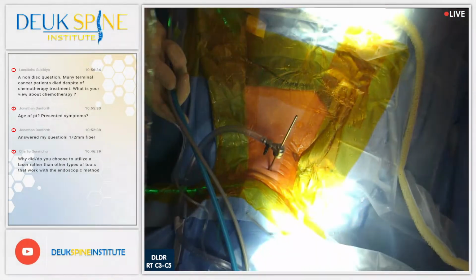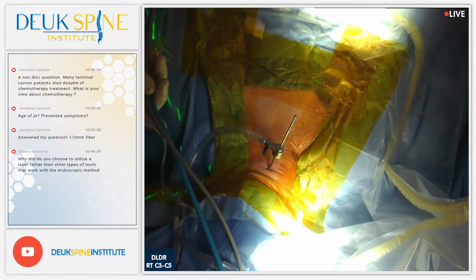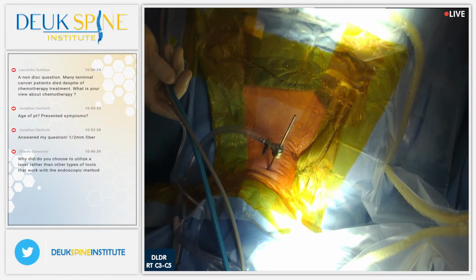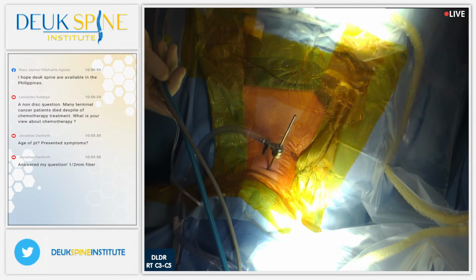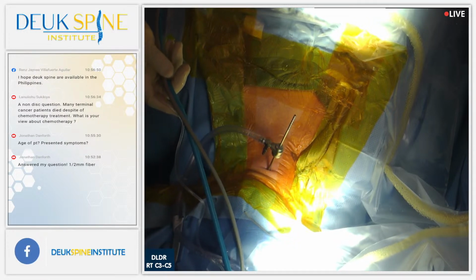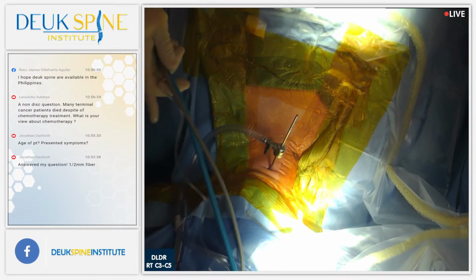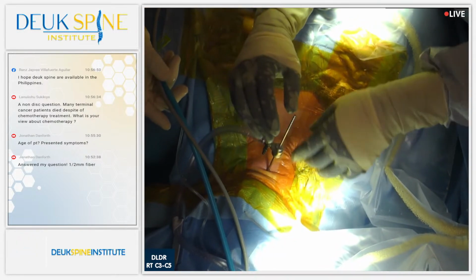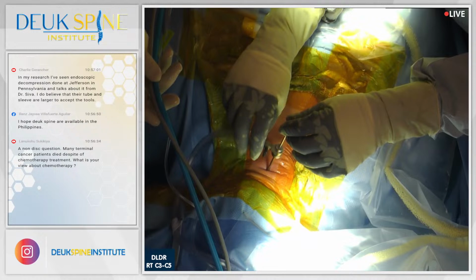You see, these herniations can be 1 millimeter or less. So if you can only see 5 millimeters and you've got sub-millimeter herniations, that's why so many people do badly with spine surgery, because the surgeons aren't doing a very good job.